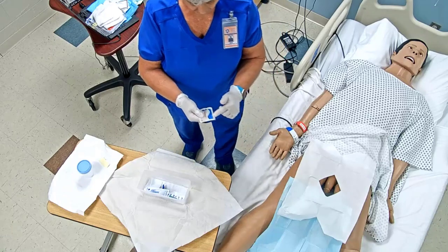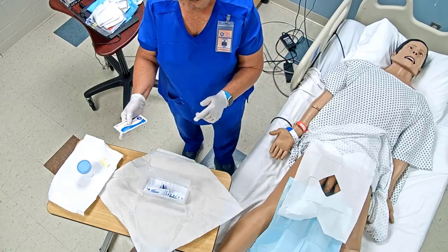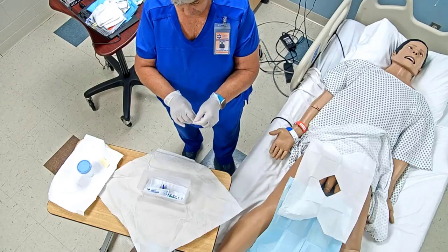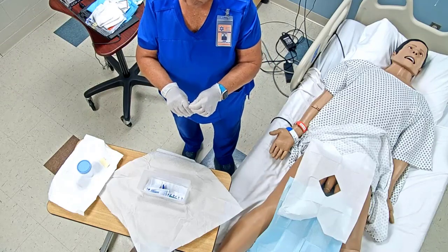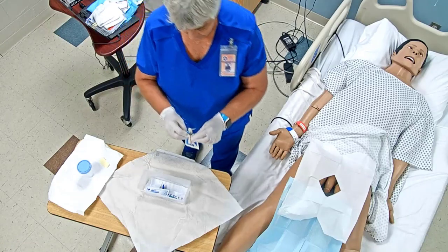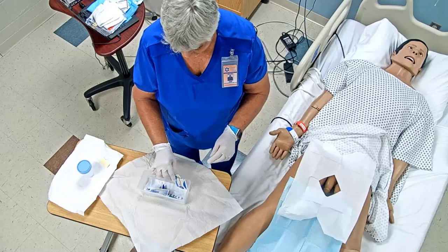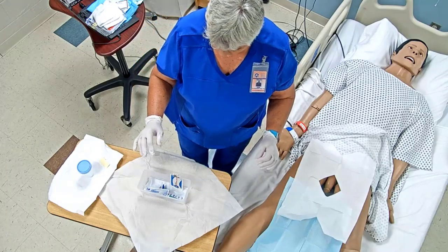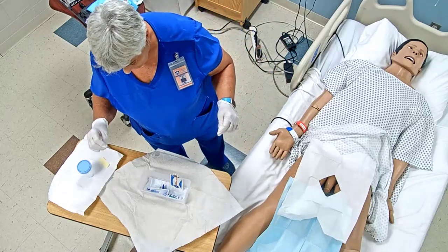And we've already checked for allergies. The package said it was iodine or betadine, and we'd already asked our patient about the allergies or shellfish. So I'm going to go ahead and, again, because of sterile technique, when you have your sterile gloves on, you got to keep them in your line of sight, so not dropping them down below our waist.